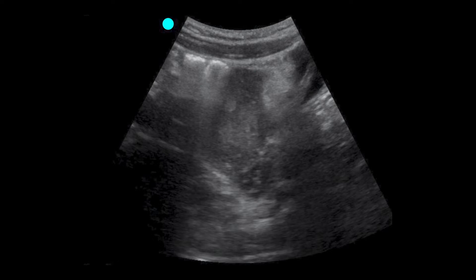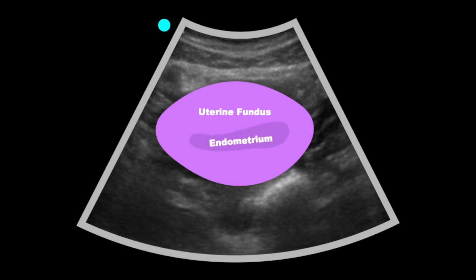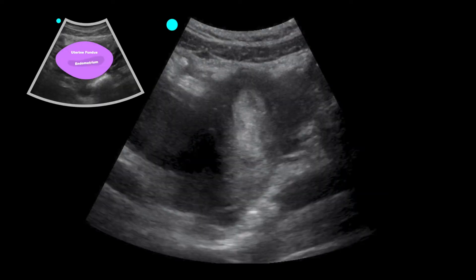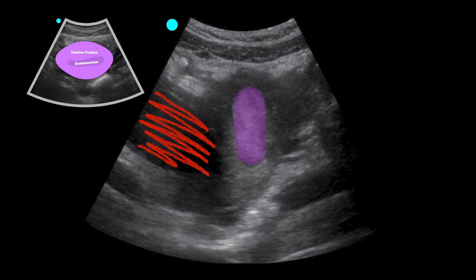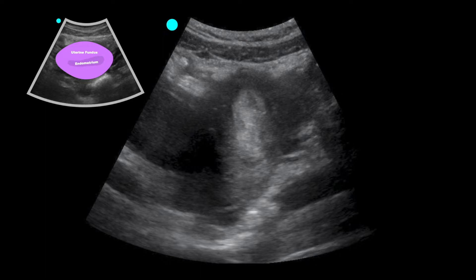After we obtain views of the long axis of the uterus we're going to rotate the probe marker towards the patient's right and get a transverse view of the uterus. I like to start at the fundus, fanning superior until the uterus disappears, then come back and fan inferior until you get to the cervix or see the vaginal stripe. In this particular patient the uterus is significantly antiverted and instead of a round shape we're getting more of an oblong shape — that's this patient's normal. We can see the endometrial stripe in the middle but we have anechoic structures we need to pay attention to, as these could be representative of pathology if the patient presents with pain.